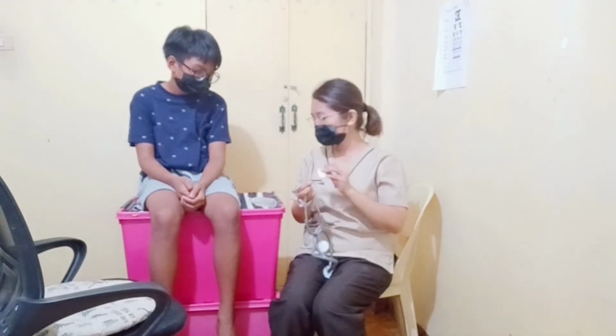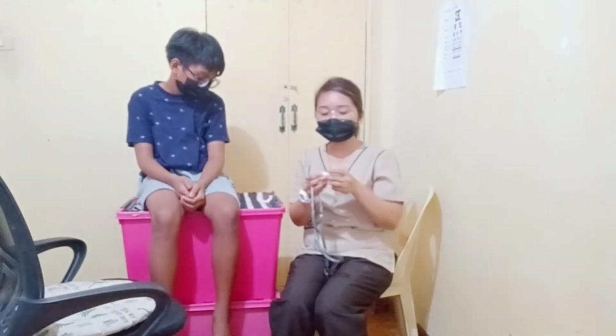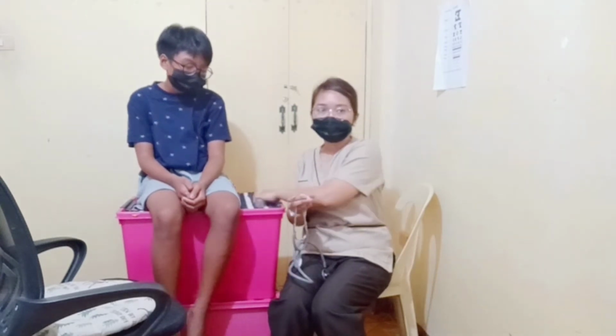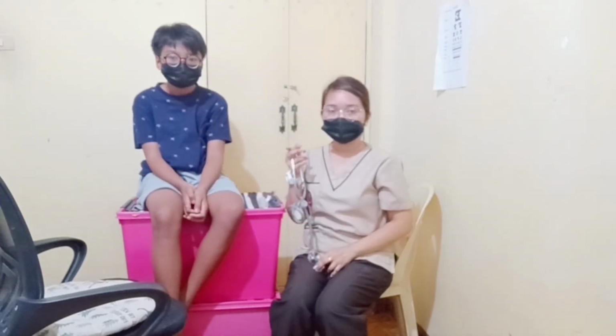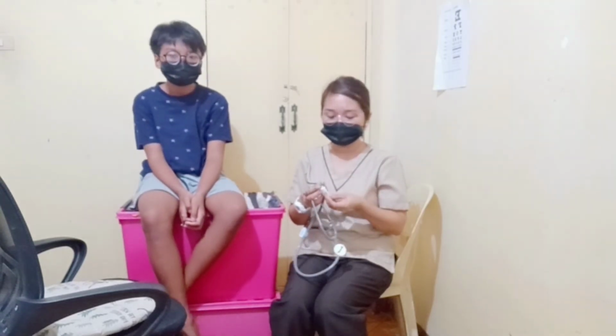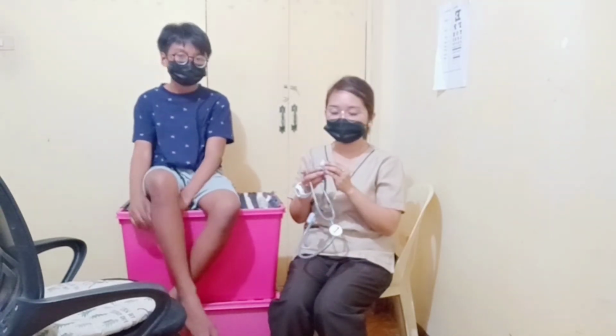Okay, we clean the earpiece and at the same time, we also clean the diaphragm. This is the diaphragm.